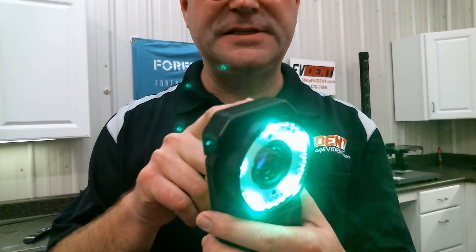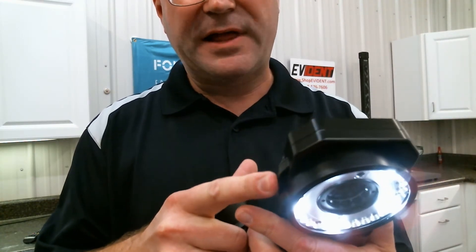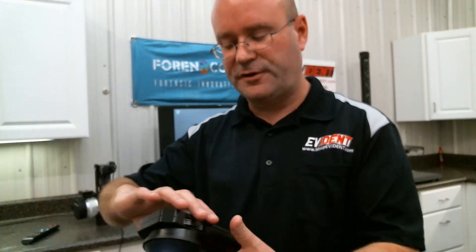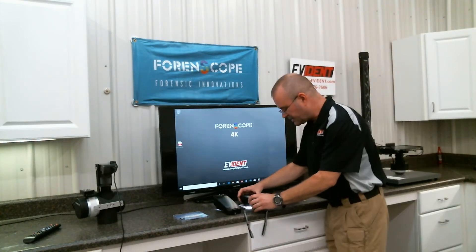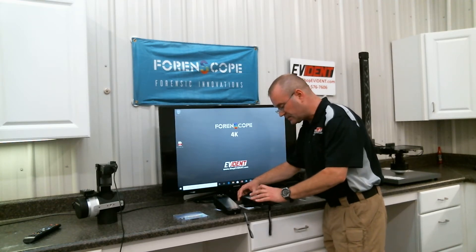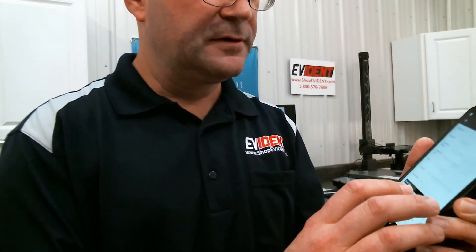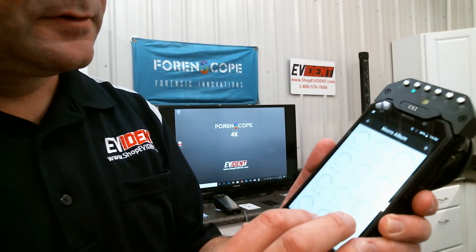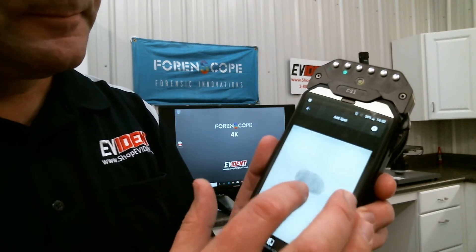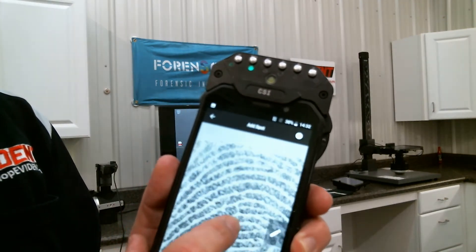Same super easy capability when capturing latents that have been processed with black powder. For example, let's go back to that lift we just took a picture of with the Patrol phone. Same setup — set the phone over the latent, tap the screen to focus, and touch the shutter button. Super quick. Super easy. You have case management software that tracks everything for you. Really, really high detail with your latent fingerprint evidence.